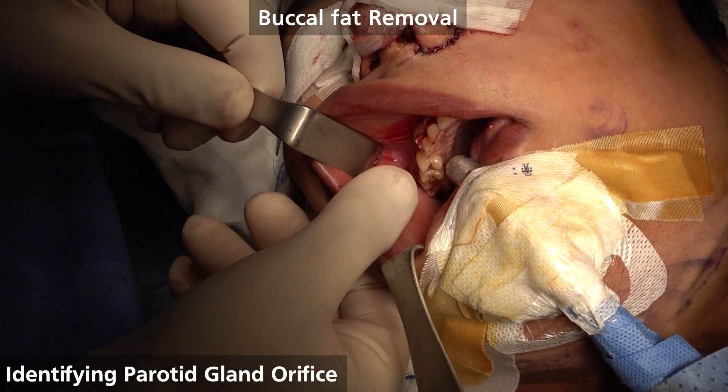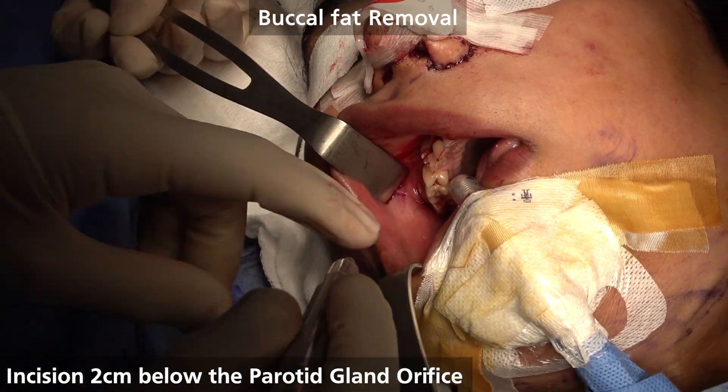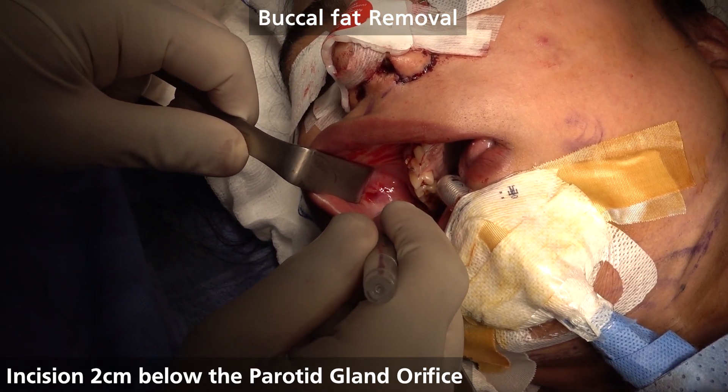So first thing when you do a buccal fat removal, you need to identify the orifice of the parotid gland. Then you go about two centimeters below and to the back.